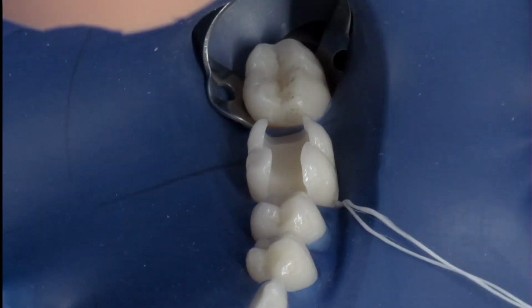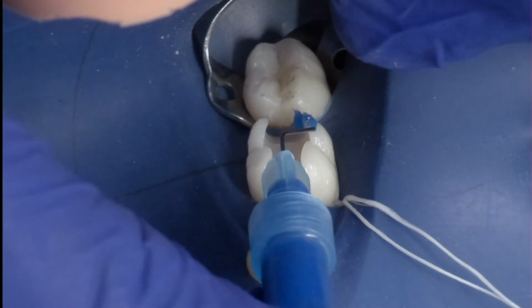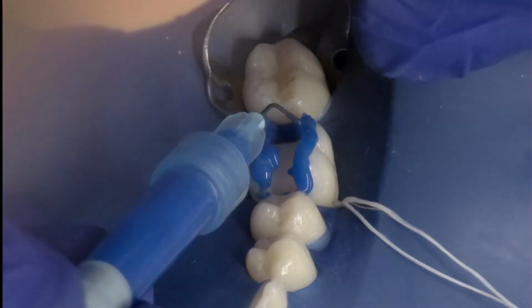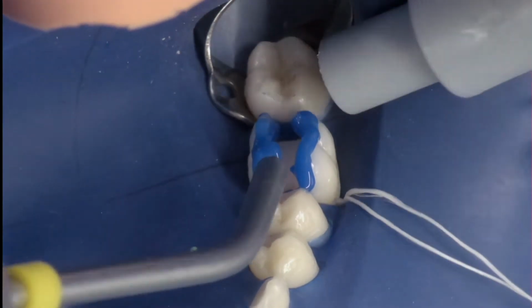I'm doing a selective etch technique where I only etch the enamel and not the dentin, to help avoid post-operative sensitivity, and also we have a self-etching primer, so it allows us to do this. 20 seconds on the enamel, followed by a thorough rinse.